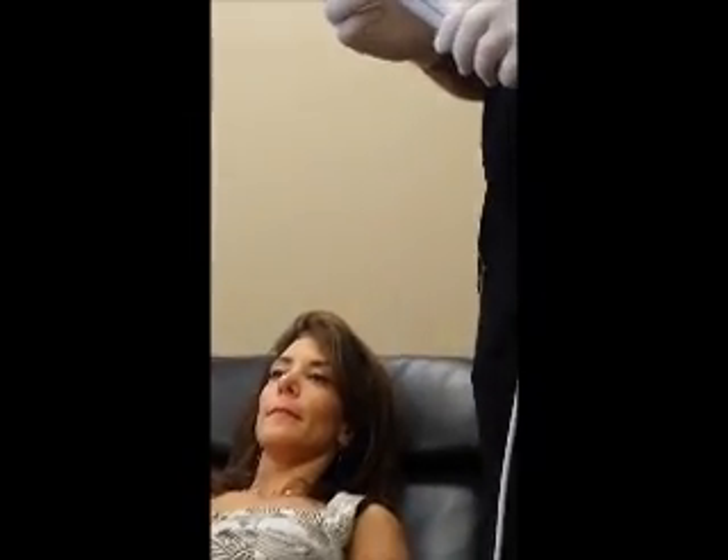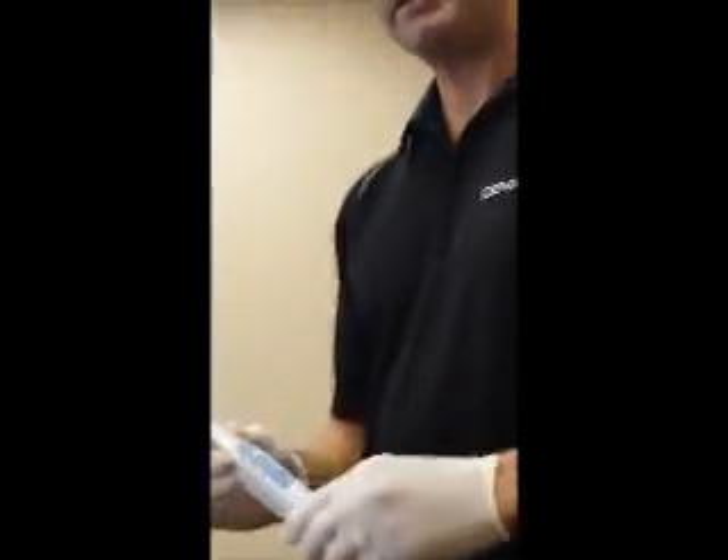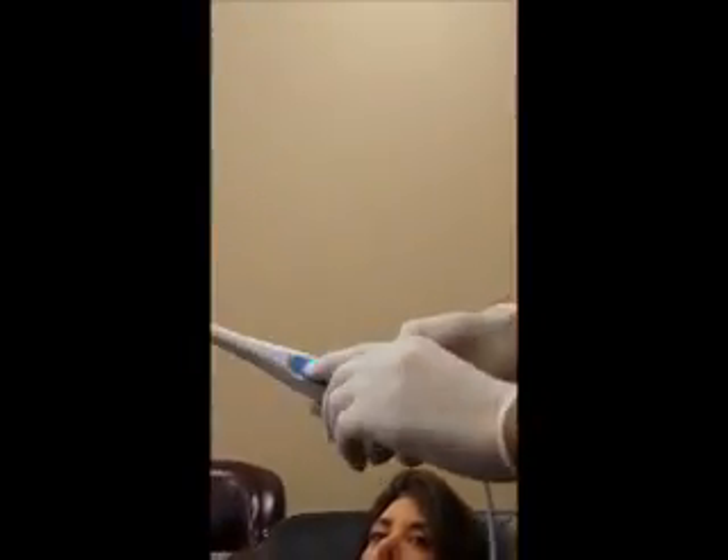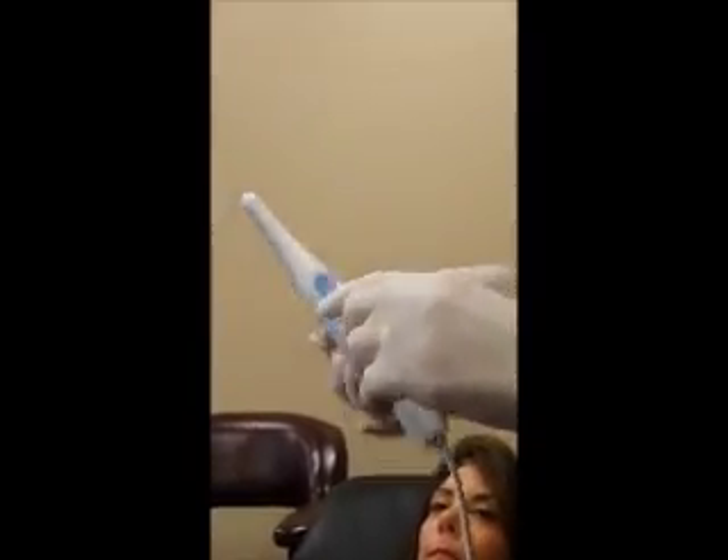This is a quick instructional video on the Telesystems camera. One of the important things is the focus. The top light is where we would be for a face shot. We're going to go through the external shots for an Invisalign series, for example, with the arch.